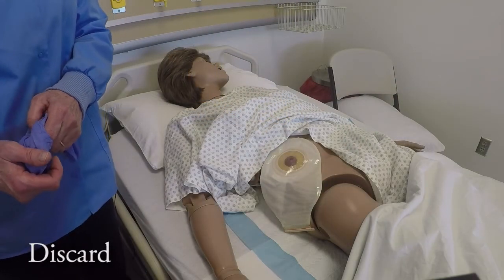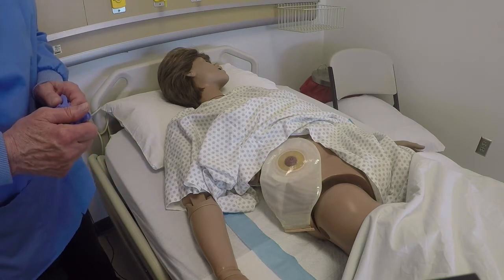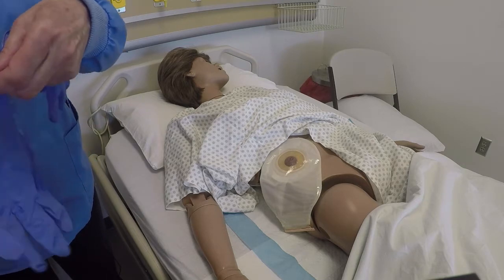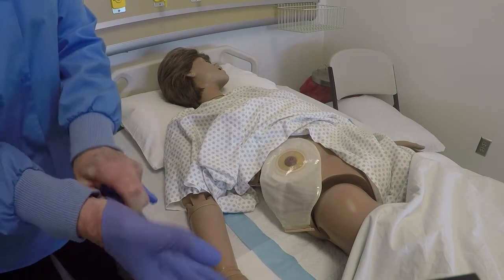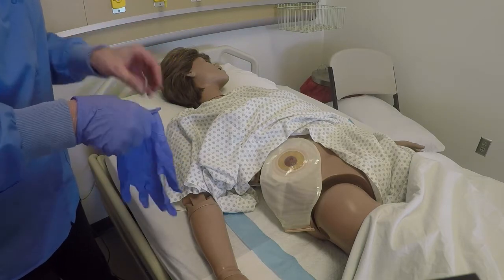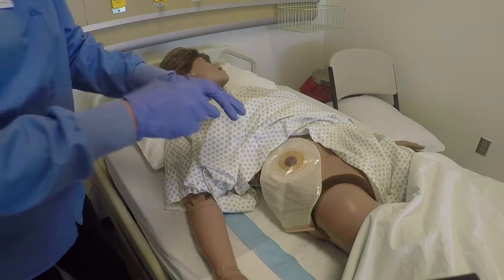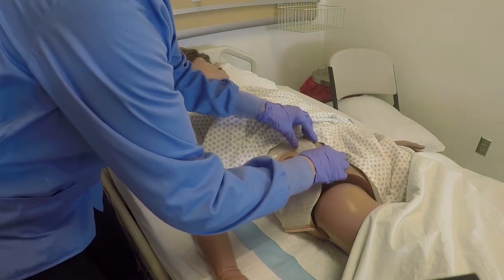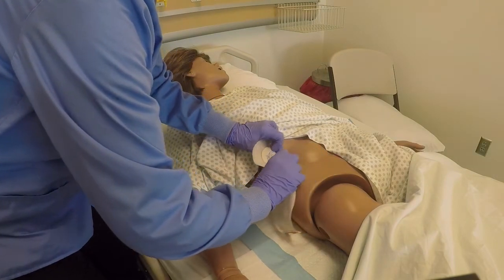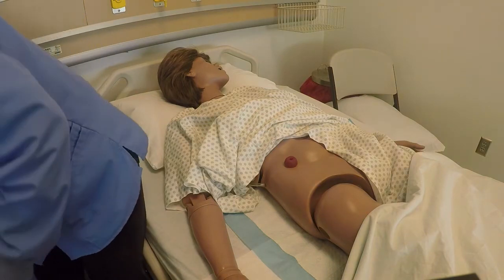D is for discard. I'm going to take off the old pouch and skin barrier. To do this, I'm going to put on my gloves to follow standard precautions. Then I will gently roll the skin barrier away from the abdomen and the skin, and discard it in the trash.